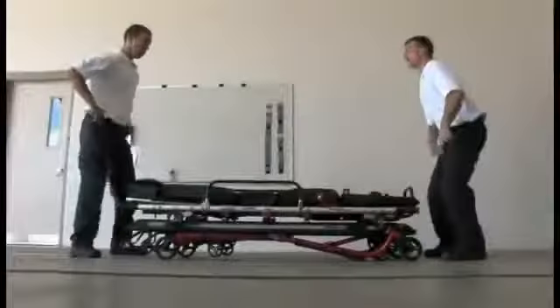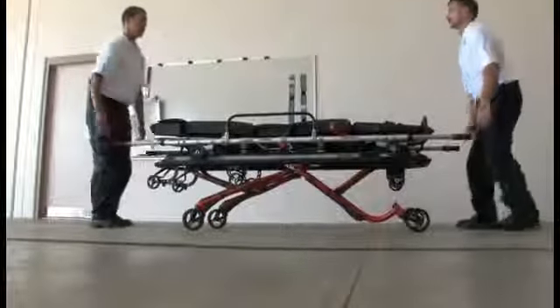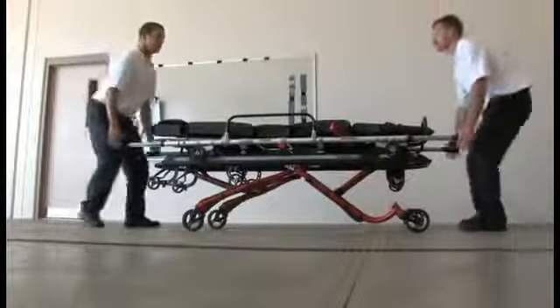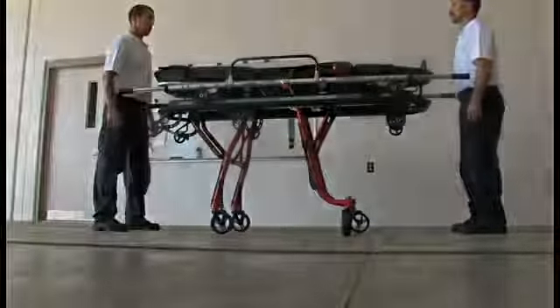The Easy Pull Release handle does not need to be used when raising the cot. Working together with your partner, grasp the transporter lift bars or the lift handles on the stretcher top and lift the transporter until it is at its desired height. The legs will ratchet and lock into position automatically.